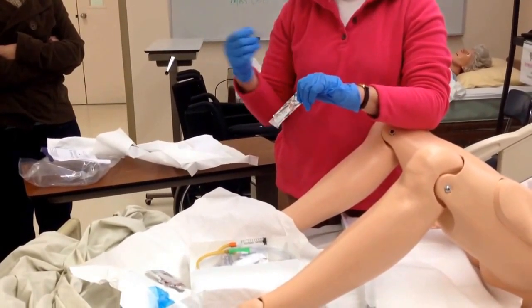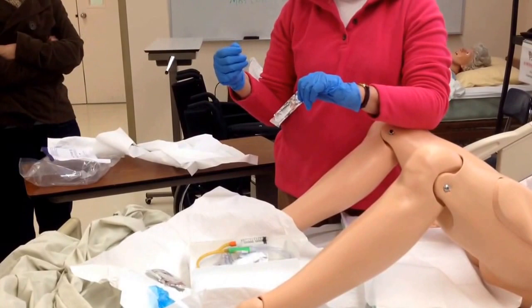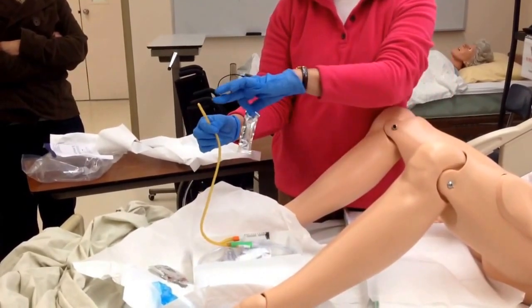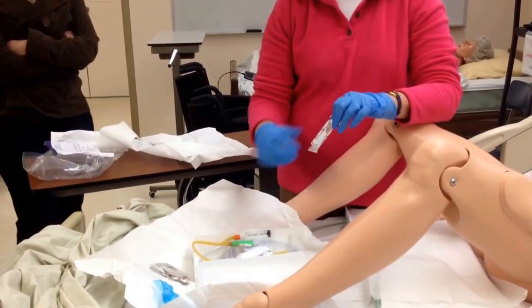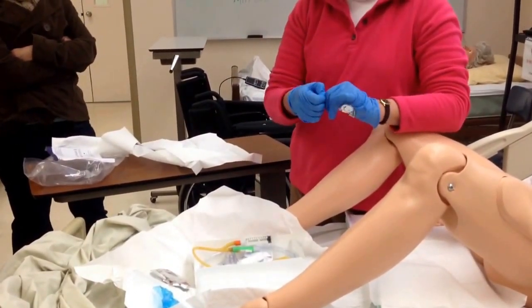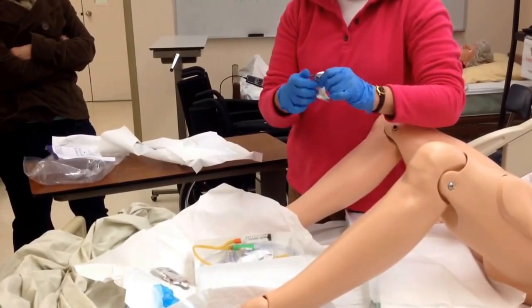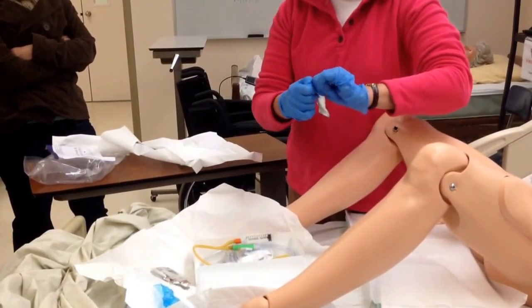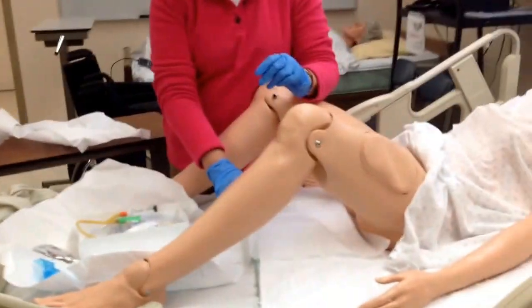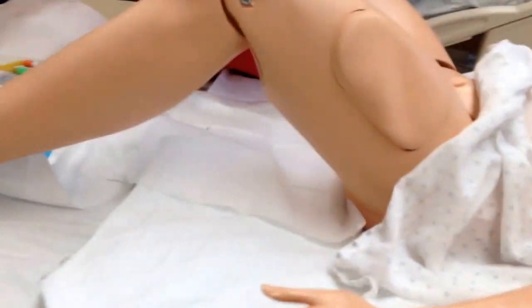It actually helps the catheter go in, okay? But it may very well clog up the end of the catheter, the port. So we just need to be mindful of that. So if you don't get urine right away, that may very well be it, okay? But it helps in that process. So I'm going to open this up. There we go, okay? So you'll just squeeze a little bit out onto your sterile field, okay?